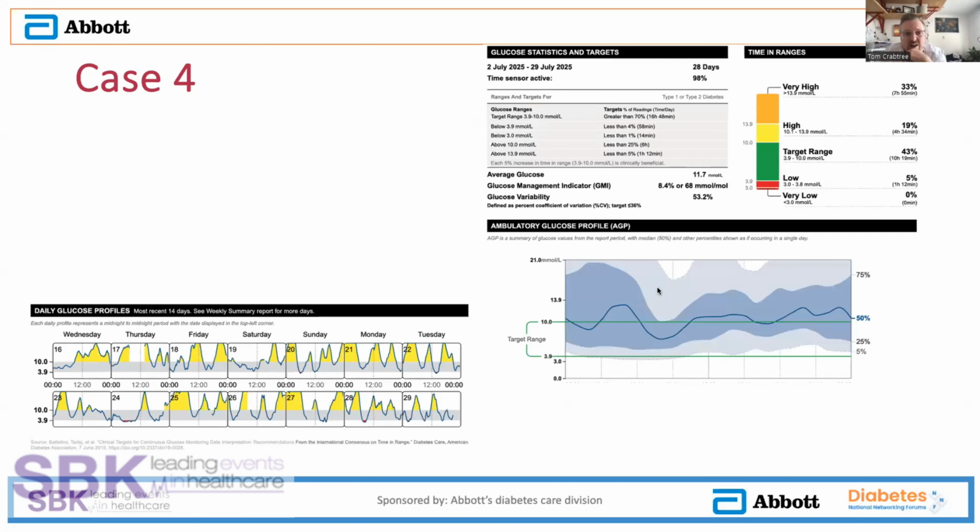And actually, this is someone who wasn't paying no attention to their diabetes. I don't think I've ever seen Libre data quite like this, where someone is alternating quite so rapidly between very high and very low. And actually, this must make you feel dreadful. She's clearly putting an awful lot of effort in because this isn't the download of someone who's not giving any insulin. This is a download of someone who's working really hard and battling against a significant complication of their diabetes.